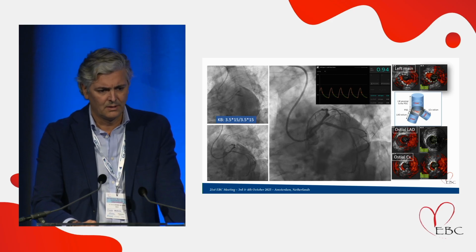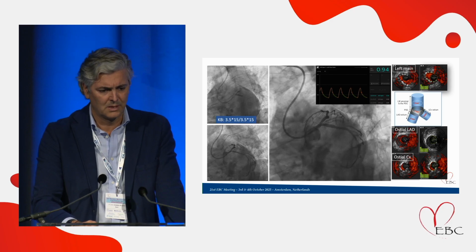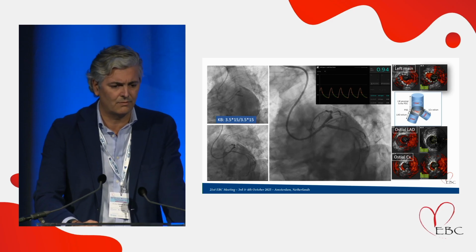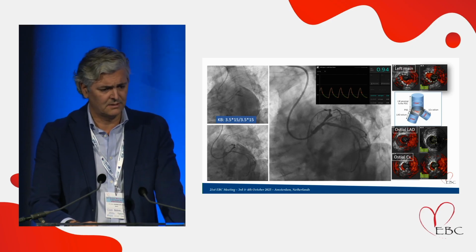We have 11.5 square millimeters in the left main, in the ostium of the LAD 6 square millimeters in a non-stented segment, and in the ostium of the left circumflex 6.7 square millimeters.